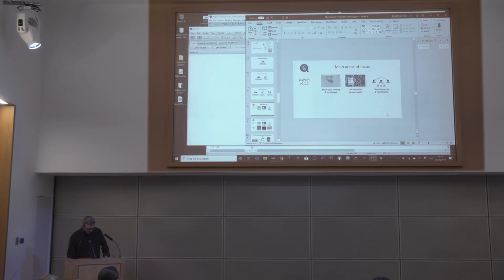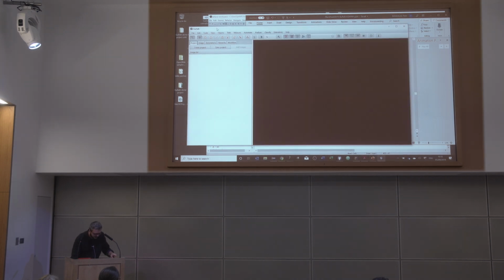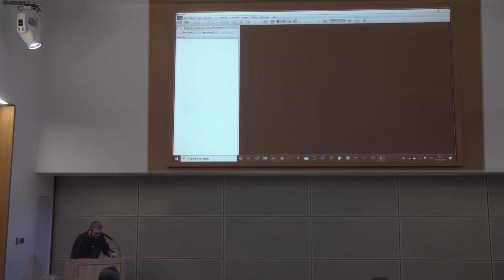I'm going to jump out of the presentation, and I'm going to try and show you this in practice. I'm going to show it to you running in debug mode, the version that I was still changing on the flight on the way over. So I do expect that at some point this will let me down, but it's more interesting to use this as opposed to the one from a couple of years ago. This is beyond the latest milestone version, the code that I'm currently working on myself.